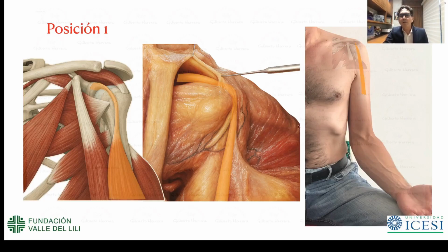We will always identify as the first structure the biceps in its long head. That is the first structure to identify. We'll see how we're going to do that in a moment. But please keep in mind that our comprehensive sequence of actions always commences with the initial and crucial identification of the biceps muscle as the primary reference point. This holds true whether we identify it at the level of the prominent pectoralis major muscle or right at the very start of the bicipital groove. Ultimately, the specific approach taken for this initial identification largely depends upon the individual examiner's clinical preference and established methodology.